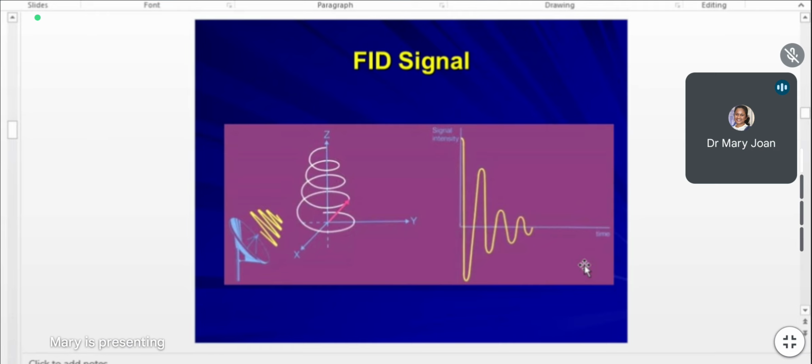So whichever we want to look at, depending on the clinical condition, if we want to look at small TE, then we will look at T1. If we want to look at long TR, then we will look at the T2 image. It is like that. But the whole thing, T1, T2, proton density, all this is happening when we are applying the magnetic field and the RF signal. So out of that, which one do you need for your diagnosis? To make a valid diagnosis, that is what we are choosing the modes to acquire. Yes, ma'am. Now understood.